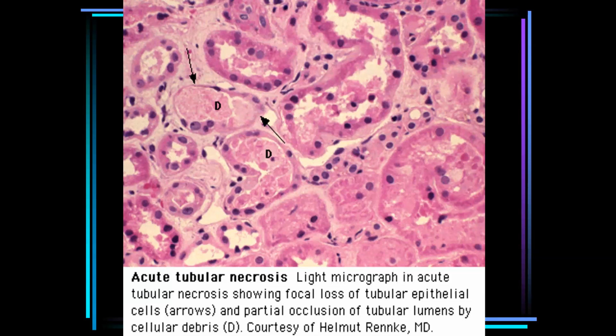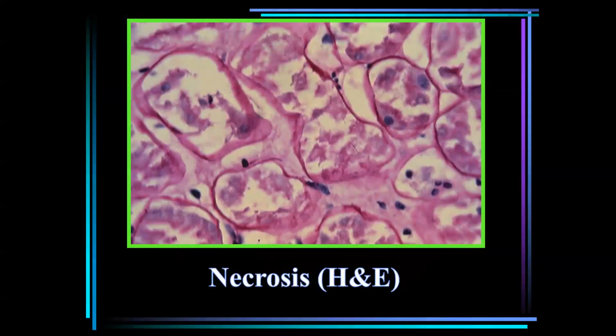But in case there is absence of a nucleus from some of the cells and the cytoplasm of the tubule is in the form of eosinophilic granules, it is called acute tubular necrosis. Again, it is part of the whole spectrum of acute tubular injury. Here is another one of acute tubular injury with severe sloughing of the cells. You see this renal tubule as if it has no tubular epithelial cells at all. This is similar in all of these findings.